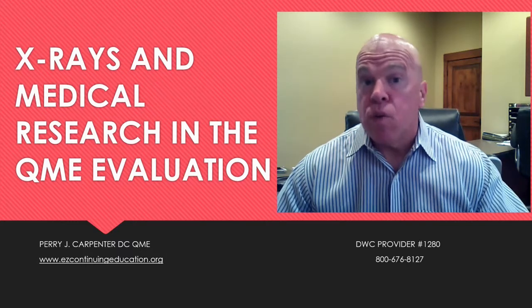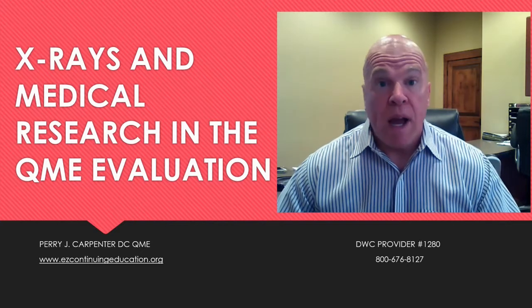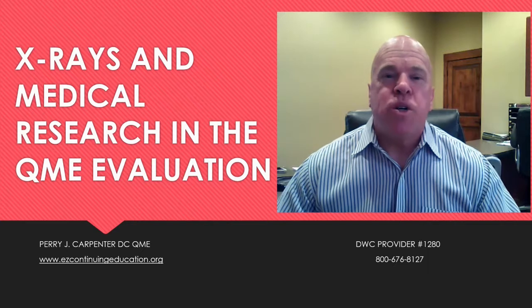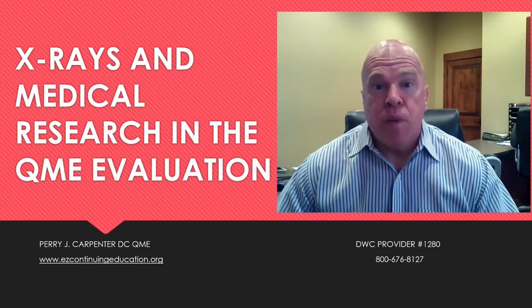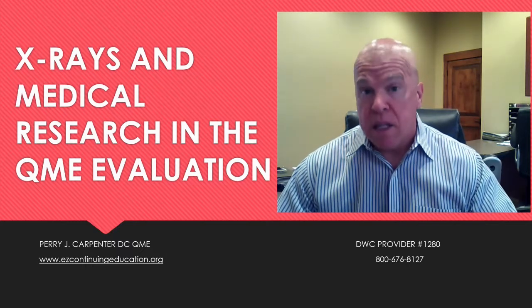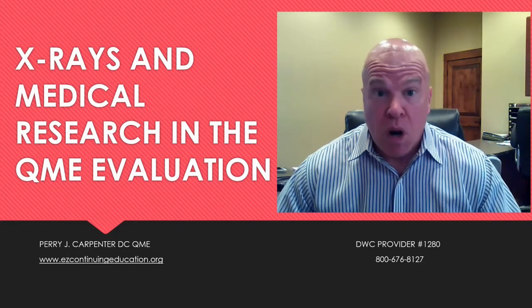So we're required to assess the examinee for post-traumatic arthritis. They either have it or they don't, but we're required to assess for it. This is assessed on X-ray studies through the measurement of cartilage intervals, okay? And these are just a few examples in the spine and the upper and lower extremities. So the point is, the X-rays are required.